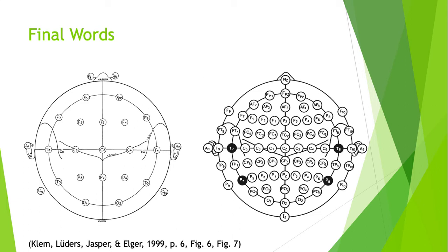However, according to Spriggs, as many as 256 electrode sites can be used for a full head EEG hookup. Therefore, the International 10-20 system can and should be viewed as the foundation of all EEG measurement systems. In order to understand and complete a proper full head EEG hookup, one must first begin with the International 10-20 system for standard polysomnography.